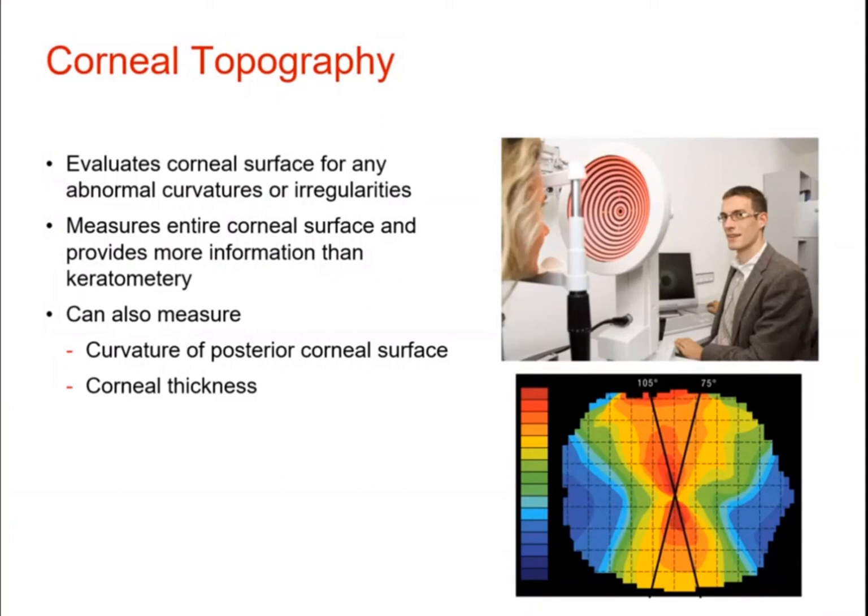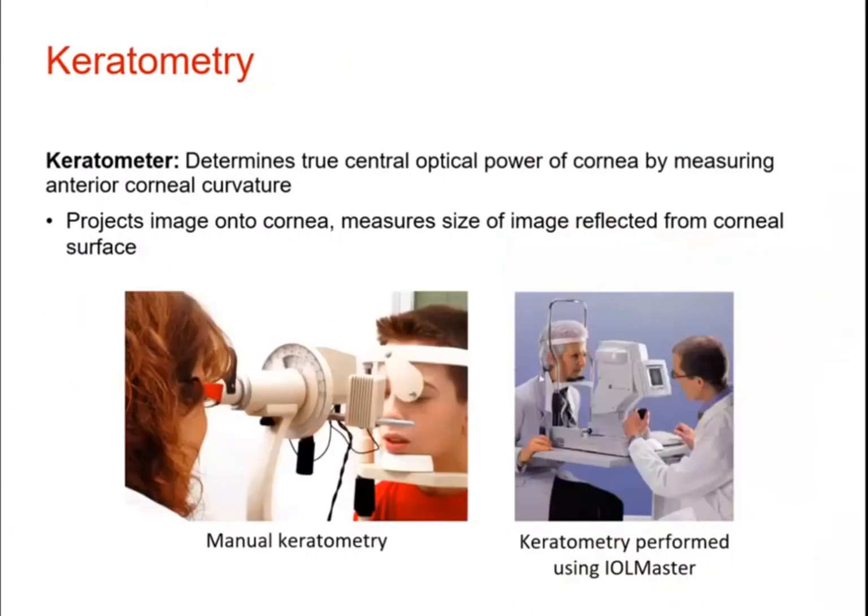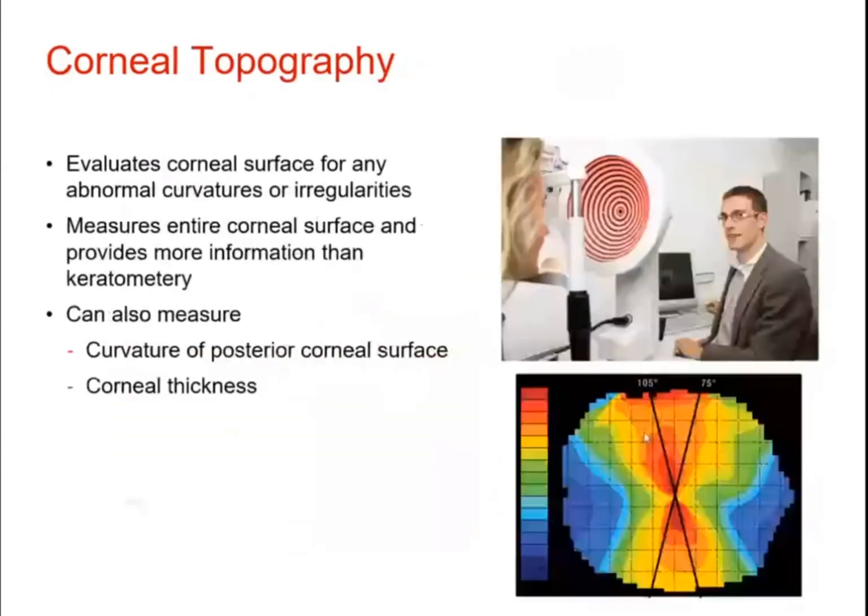So it's important to be able to screen out these patients, because otherwise it may give a surprise when you're thinking you are correcting regular astigmatism, but in fact the patient has irregular astigmatism, and the results post-op after implanting a toric IOL doesn't seem to correct the astigmatism, or the astigmatism actually becomes worse off.